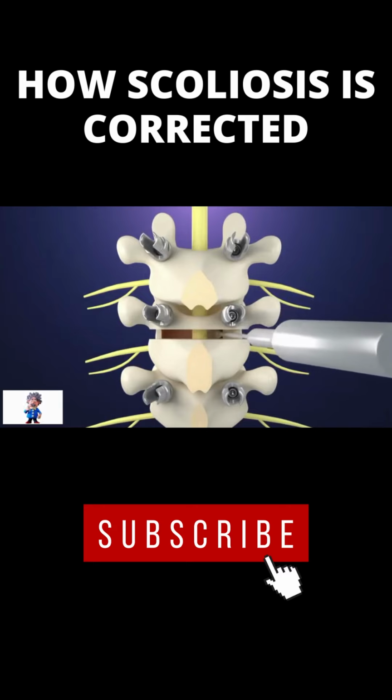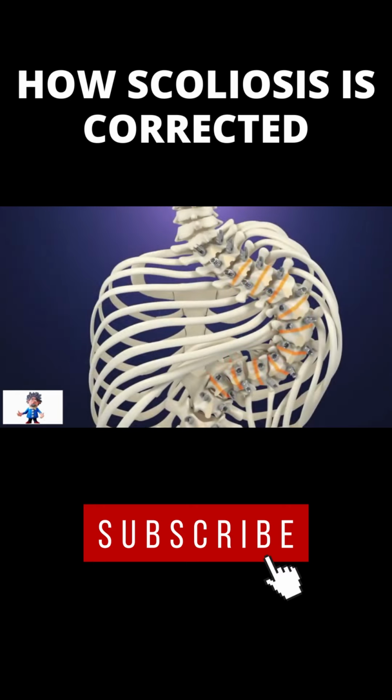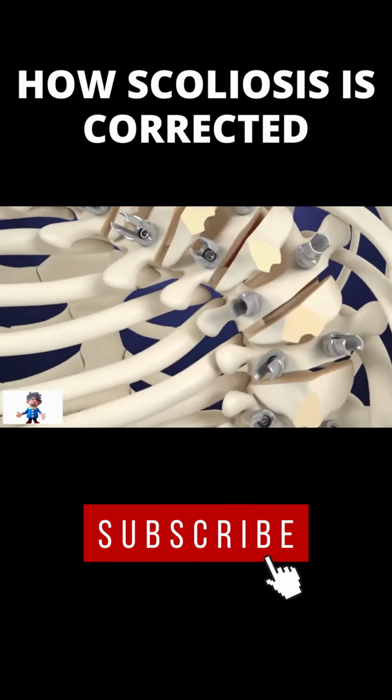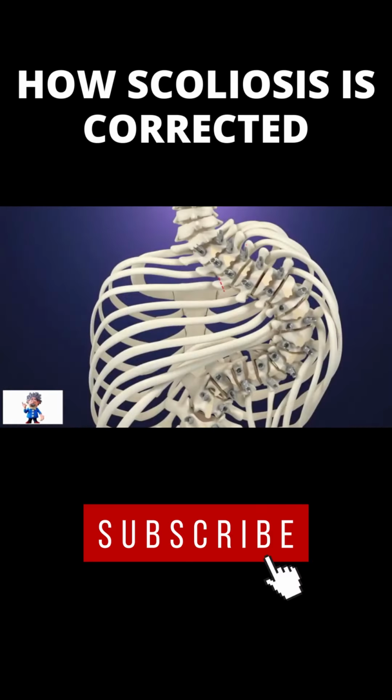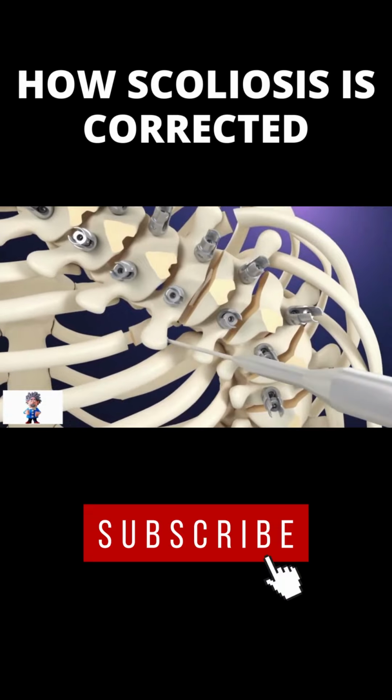Still using the burr, the vertebral bodies and discs are then partially removed. And finally, the surgeon cuts the ribs.